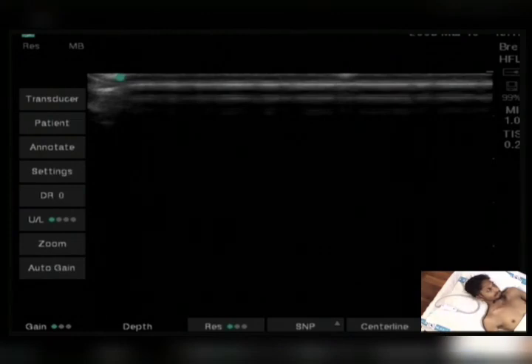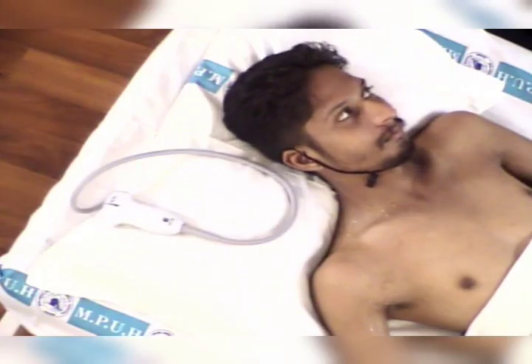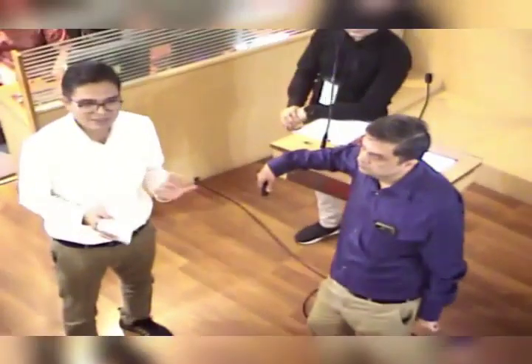See, I decide based on my convenience. But if we say it depends on surgical type, like if the block is for the lower humerus or above the elbow, then I will go with supra or interscalene, mostly supra. If the surgery is below the elbow, then I utilize axillary or costoclavicular or infraclavicular. But in my usual practice, I utilize costo, supra, interscalene.